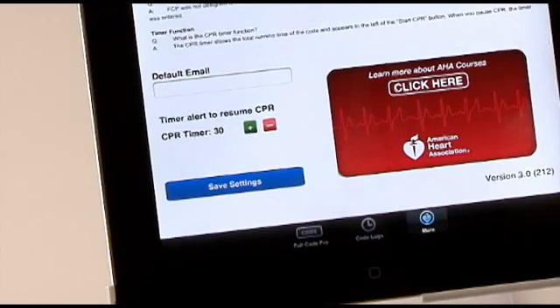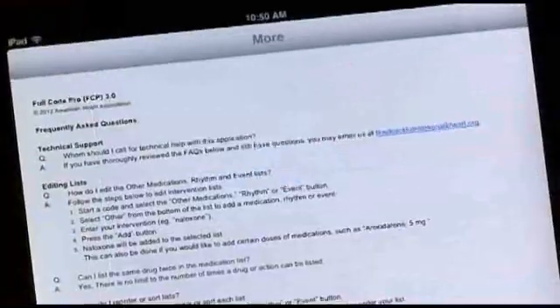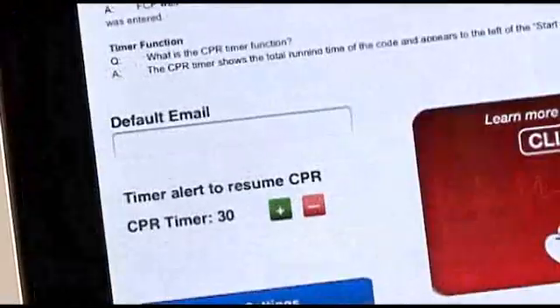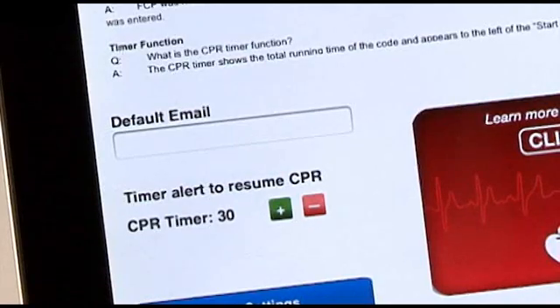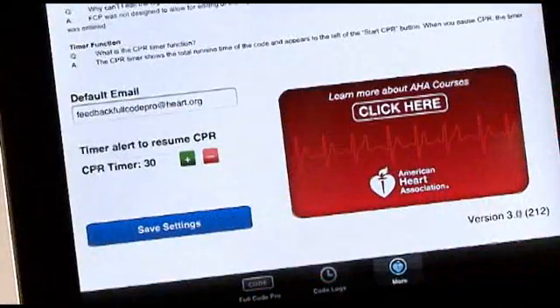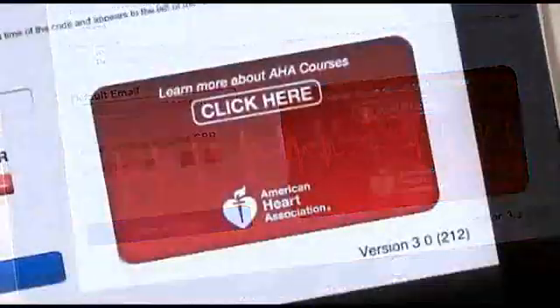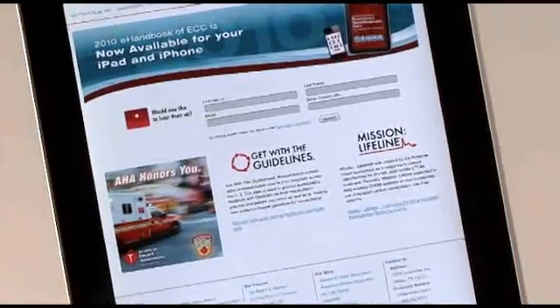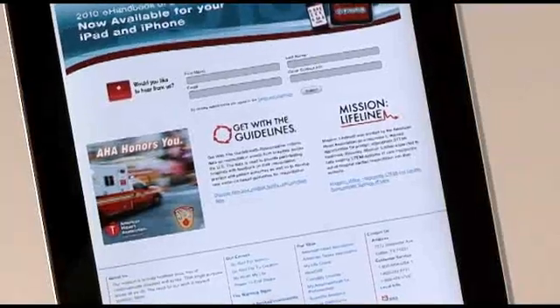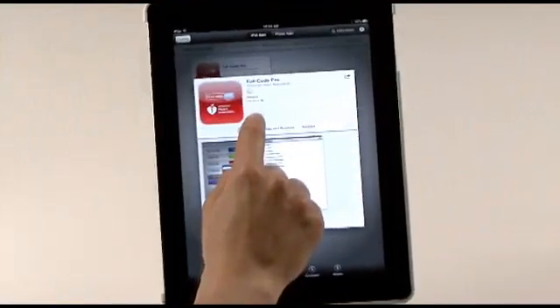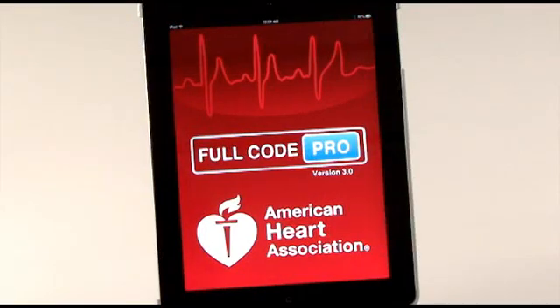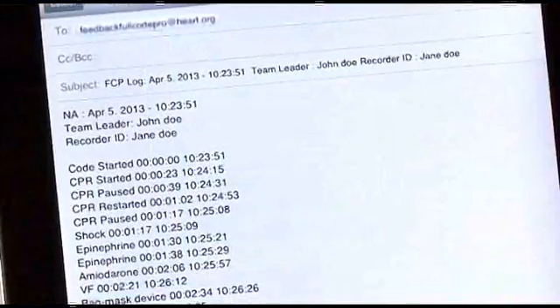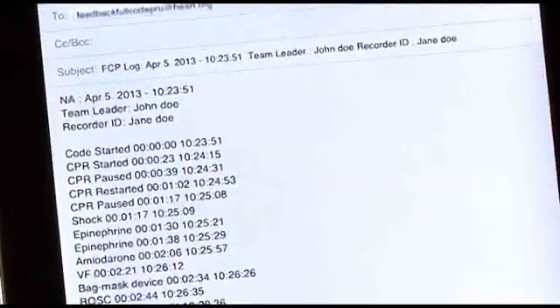There are other valuable functions in the More section. There are helpful frequently asked questions — you can scroll down to see more questions and answers. You can create a default email address from this page. Enter the email address, then press Save Settings. Also, click on the big red block to get linked to a webpage with more information about AHA programs and courses. Using this real-time app to log your actions can improve the availability and accuracy of documentation of a resuscitation event. You have robust data for review, debriefing, and resuscitation quality improvement.